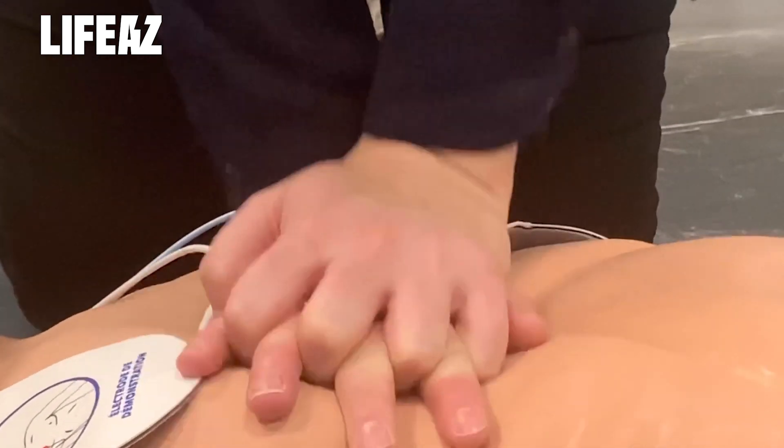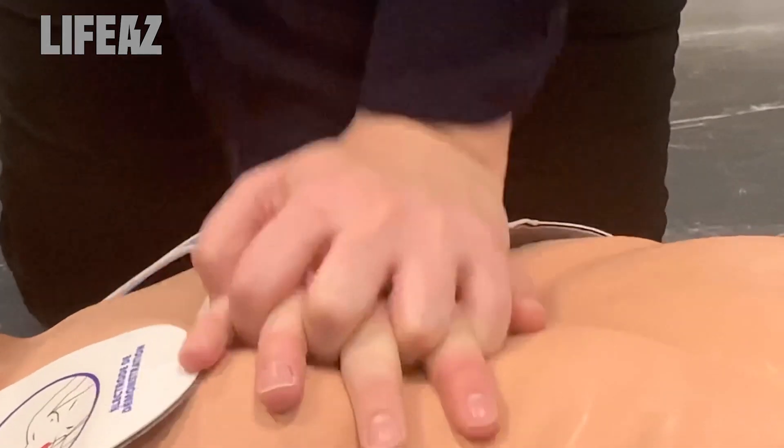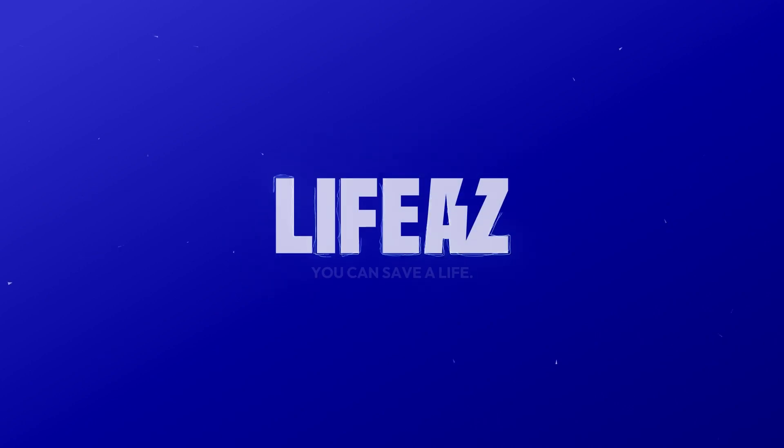Now you have all the information you need and you're ready to go. You don't need training to save a life.